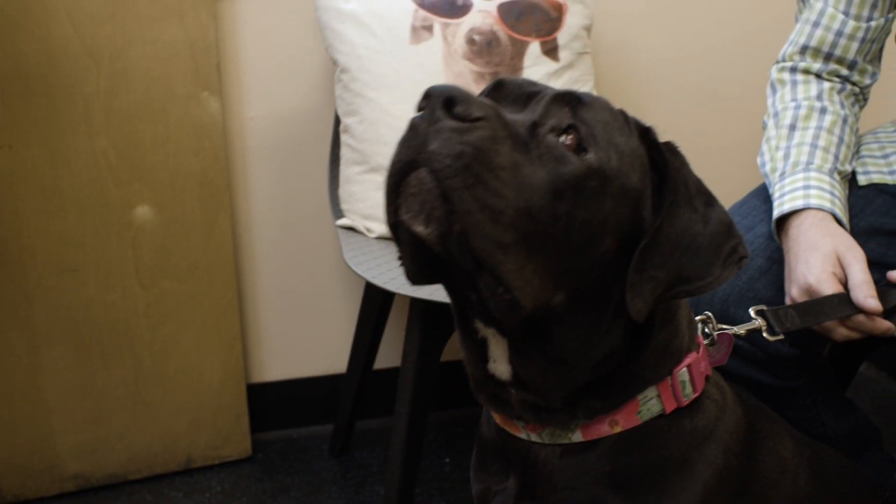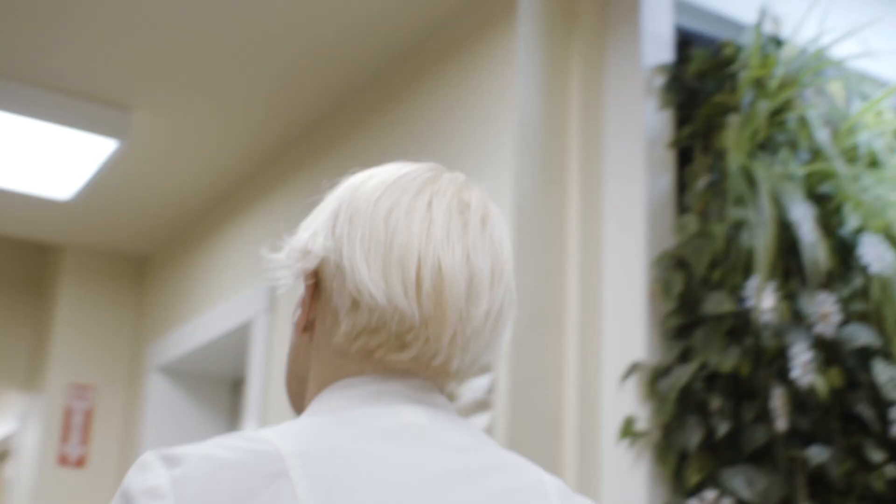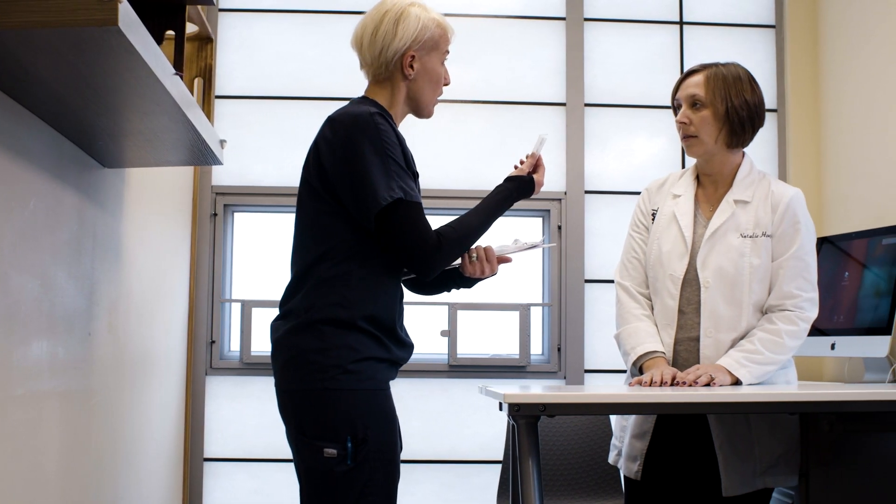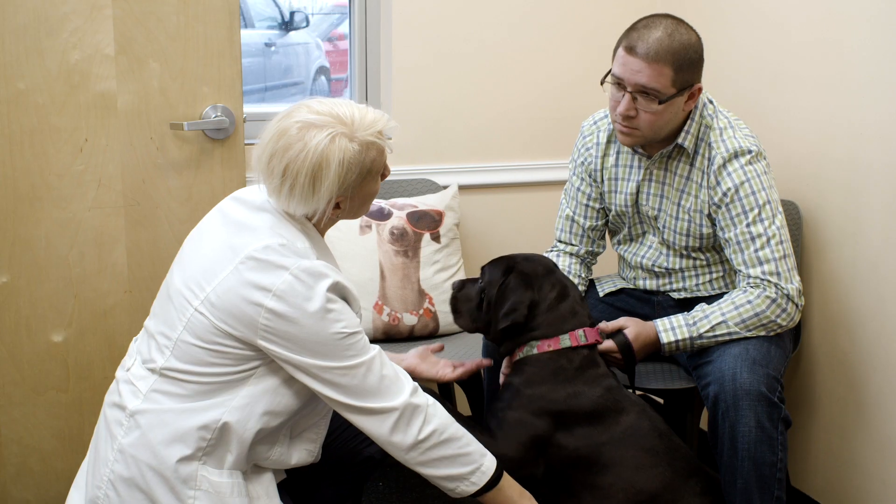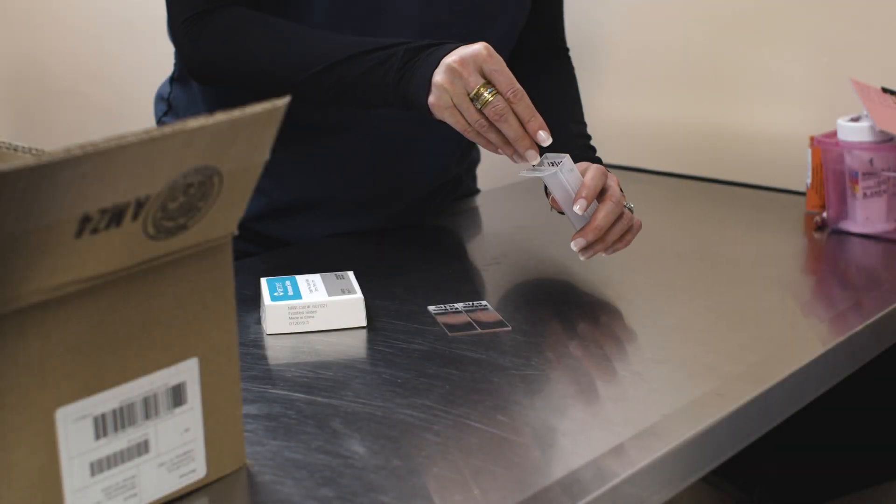In vet school, veterinary students learn the luxury of fast pathology turnarounds. On rotation in the teaching hospital, they walk critical samples down the hall to the clinical pathologist for interpretation. Cytology diagnoses are made fast and easy as they should be. Treatment decisions are made in real time, and anxious pet owners get answers fast.